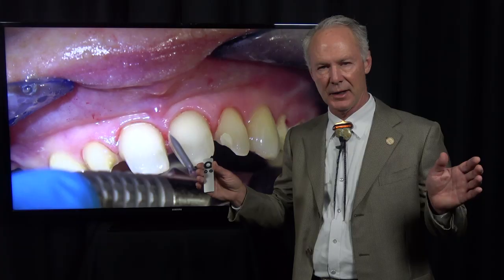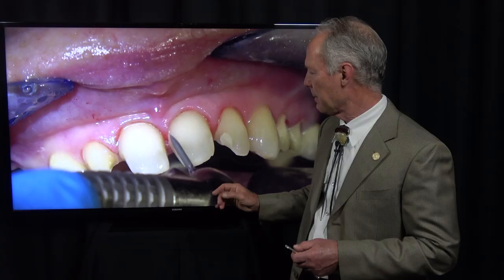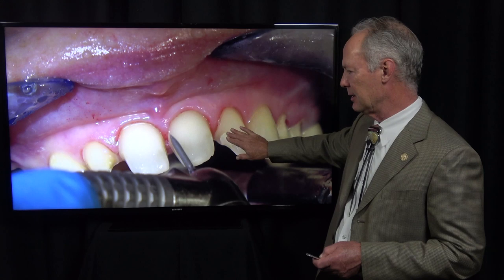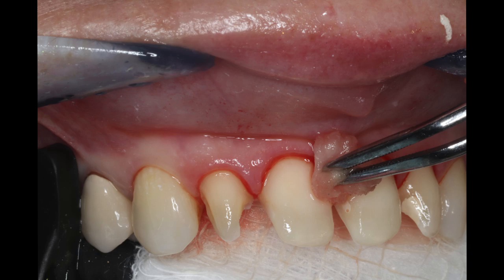Also, if I had interproximal decay, I would not remove the decay at the time of tooth preparation unless there was a lot of decay. I would wait till I'm seating the veneers. I've got some other videos on how I do that. But what I would do at the seat appointment, I would go in and remove the decay and then place a highly filled resin and not cure it, like I'm going to do here in just a minute, to replace this part that's broken off.